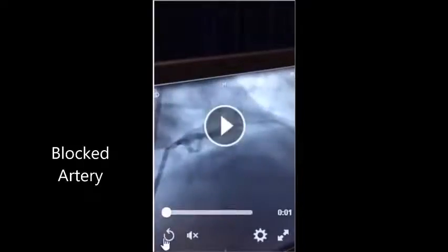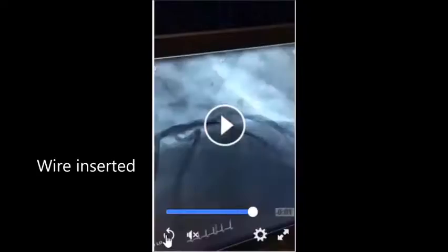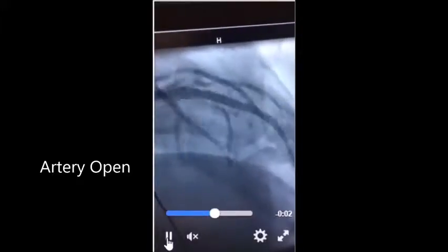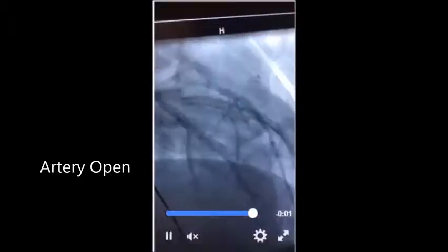In the first angio we can see the artery is blocked. In the second angio we can see the wire being inserted through the artery. And in the final angio we can see that the artery is open again.